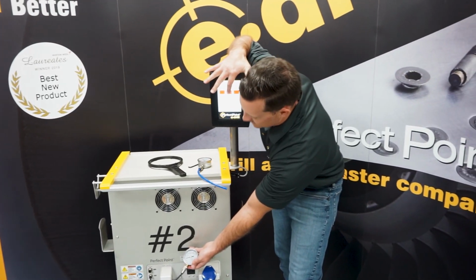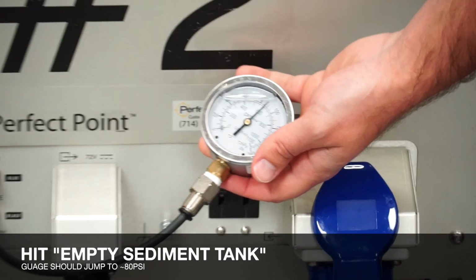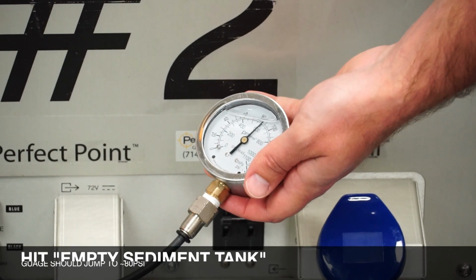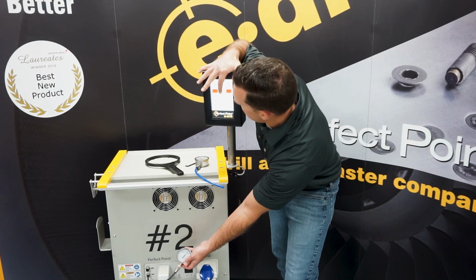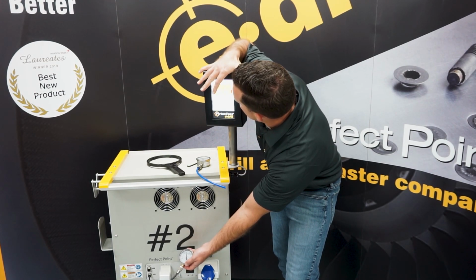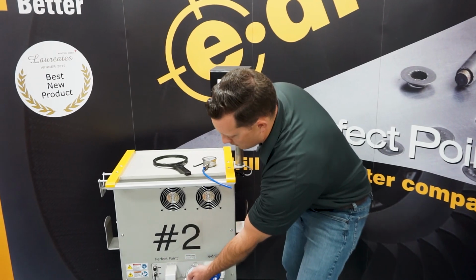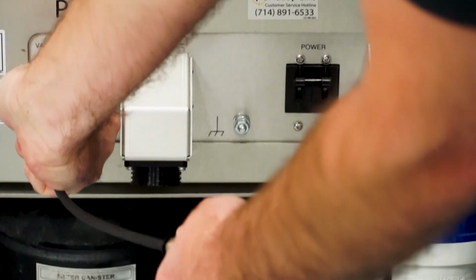Then we're gonna run empty sediment tank and watch that needle jump up to 80 PSI, or a little bit above. Between 80 and 90 is perfect pressure. Since we're there, it's a nice constant stream. Turn the pump off, we're gonna say no, and then just release the pressure.